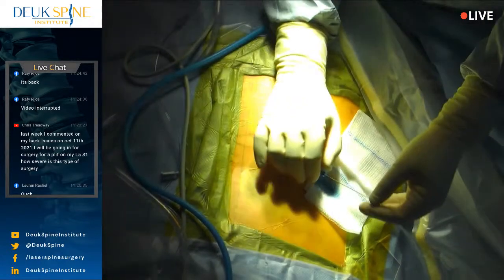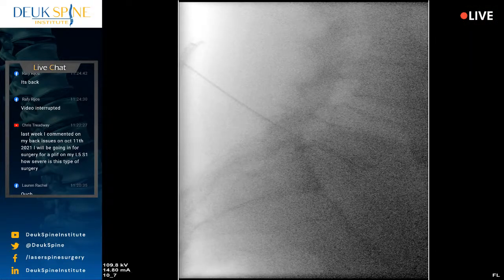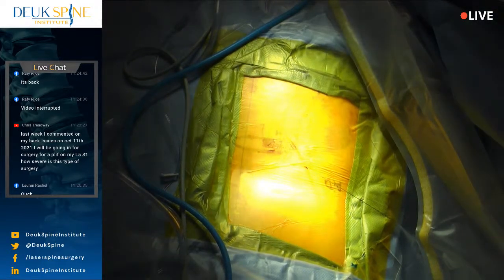Shot? Now we've got the guide wire in. And so we're going to remove our needle because we're done. And we've successfully navigated from the origin where we started our journey, which is out here in the operating room, specifically right here on the skin. And we've navigated down to our port of call, which is the L5-S1 left-sided annular tear within the neural foramen, okay? That's not blue blood. You might be tempted to think it is, but that's the dye we use in the discogram.